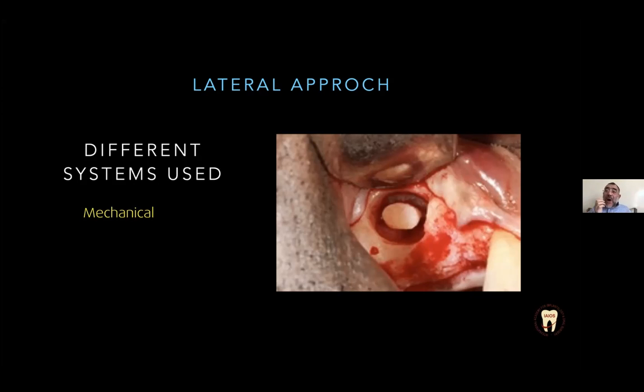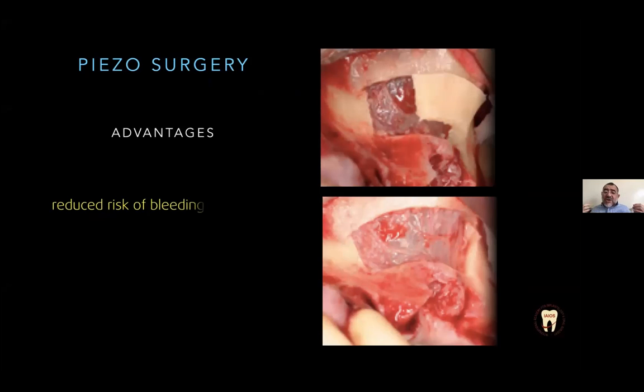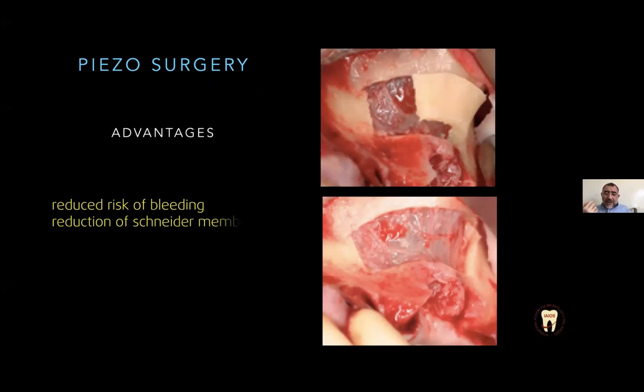And now you are very lucky to have piezo-surgery in your practice, because that resolves many problems of perforation and many problems of bleeding around the sinus. The advantages of piezo-surgery are that it reduces bleeding in the site of the surgery, reduces Schneiderian membrane tears, and protects the flap.